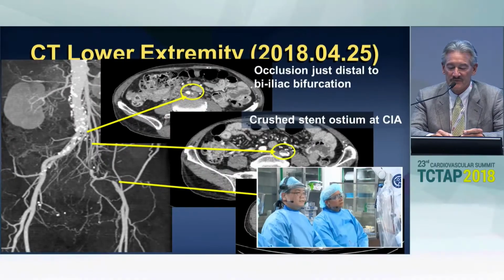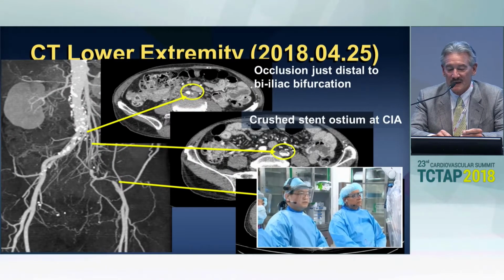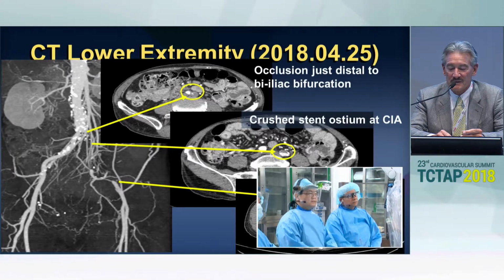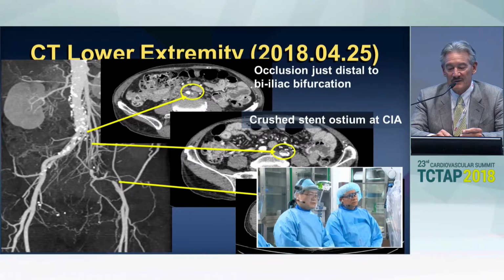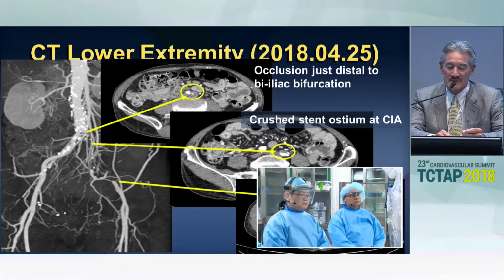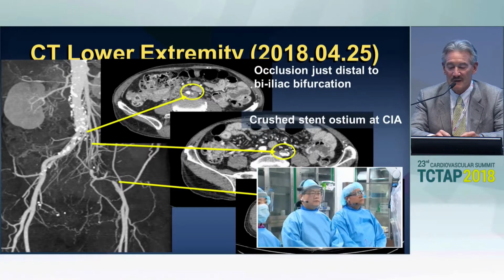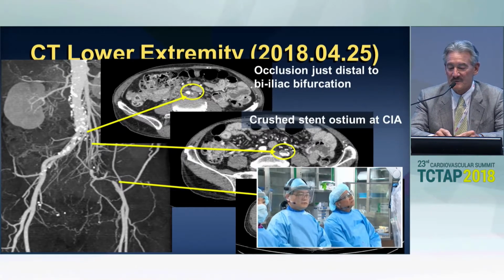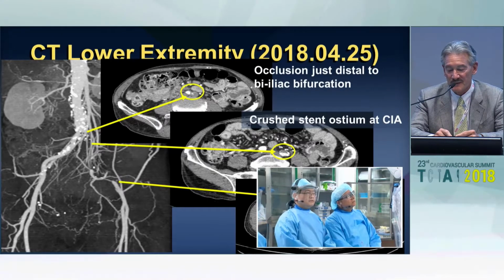It wasn't fully expanded at the original implantation, and I saw quite a bit of calcification where it was not completely expanded. So it could be a lack of complete expansion 6 years ago, and maybe some additional extrinsic compression from the calcium subsequently.